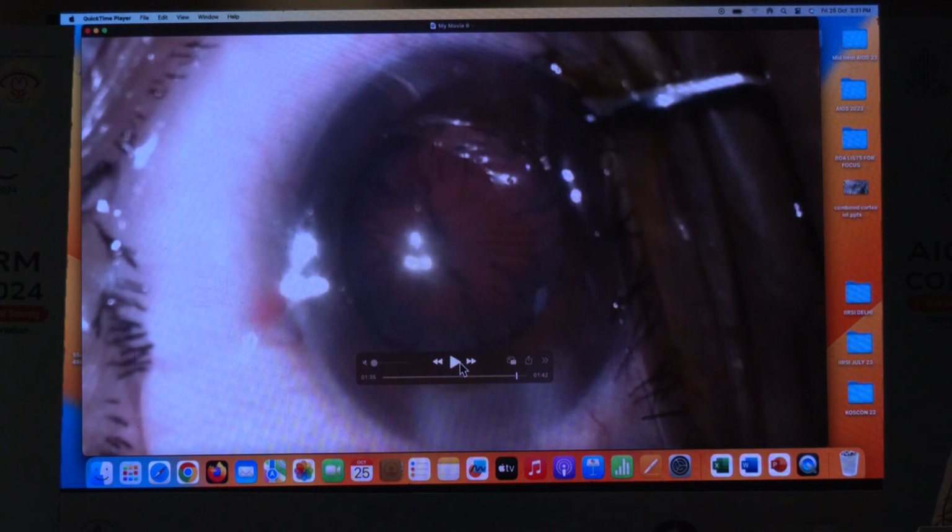Now see what has happened. You have seen the pupil was becoming smaller, then pupil was becoming larger. And because of that, the phacoemulsification was very difficult. So I want madam to tell what you will think in such a situation.